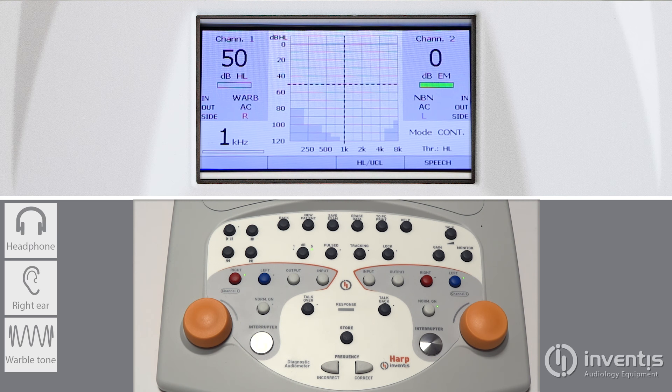Interrupters are available both for channel 1 and channel 2. Simply touch them to send the stimulus through the respective channel.